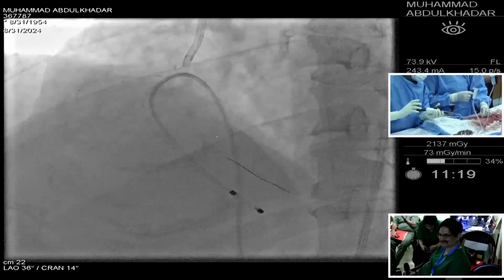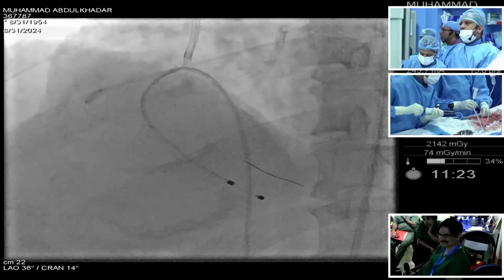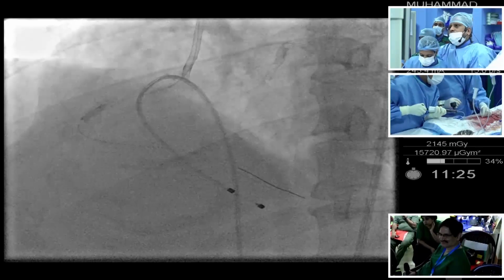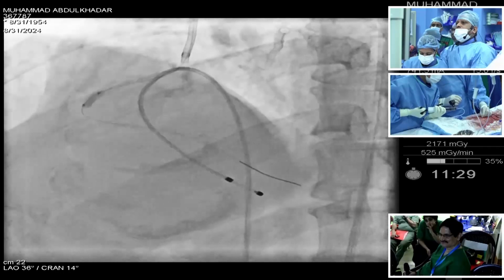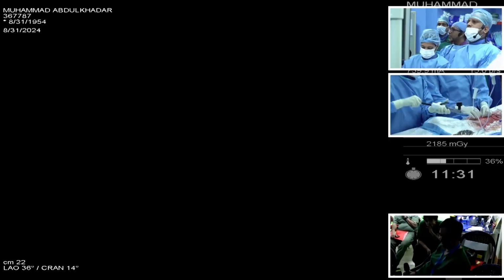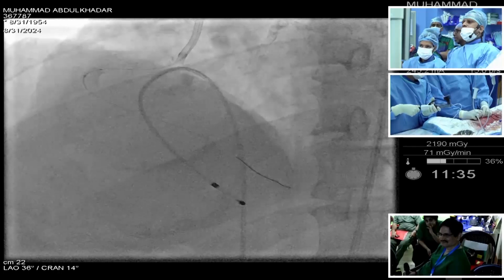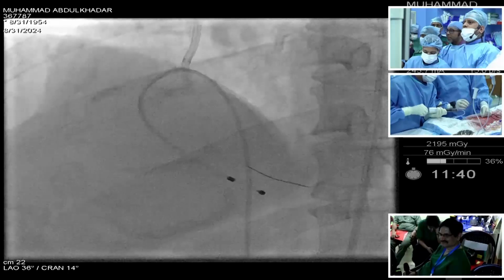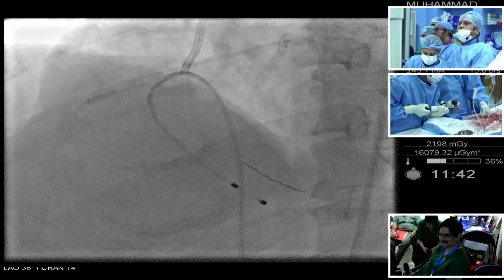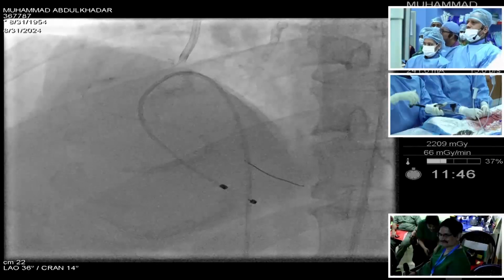Always, any calcified lesion, you have to have both these strategies. You need to have an ablative strategy, and you also need to have a balloon based strategy, 14, 16, 18. When you think of an ablative strategy, it is always either rota or orbital, and at times laser in uncrossable lesions, followed by a balloon based strategy.